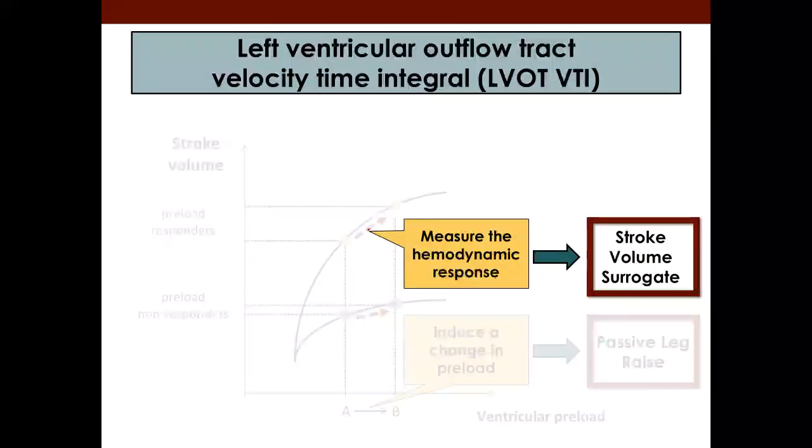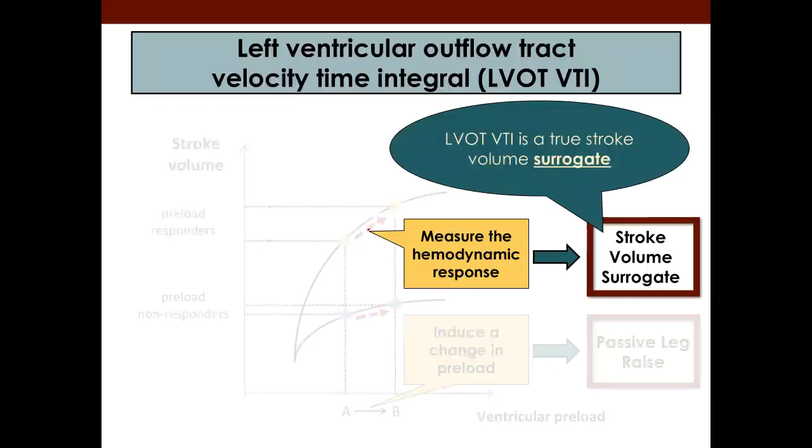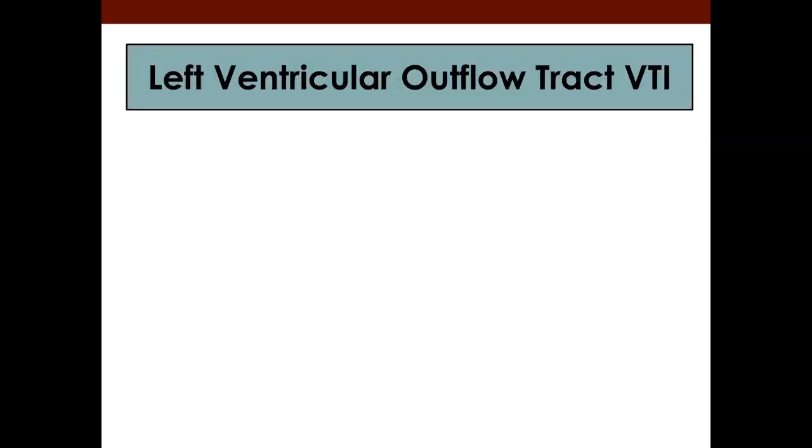All right, let's move on to the next thing, the next ultrasound assessment. And this is left ventricular outflow tract velocity time integral, LVOT-VTI. LVOT-VTI is, in fact, a true stroke volume surrogate, which is great. And let's talk about now how to do this.